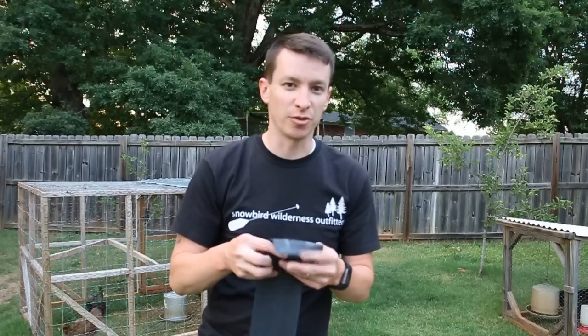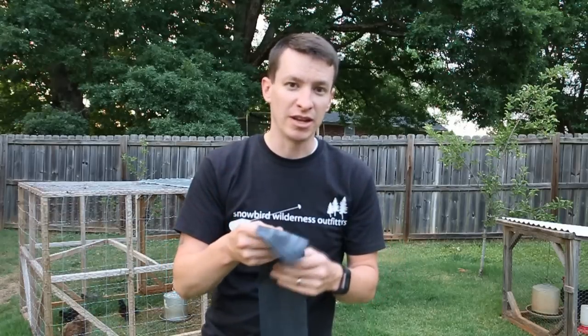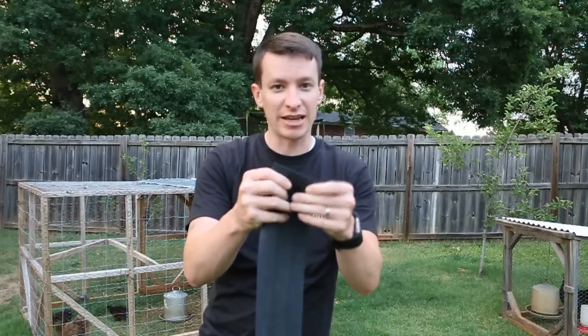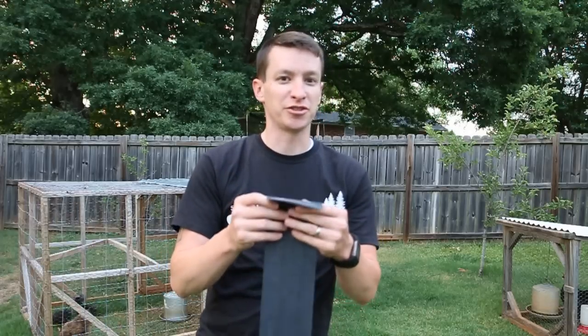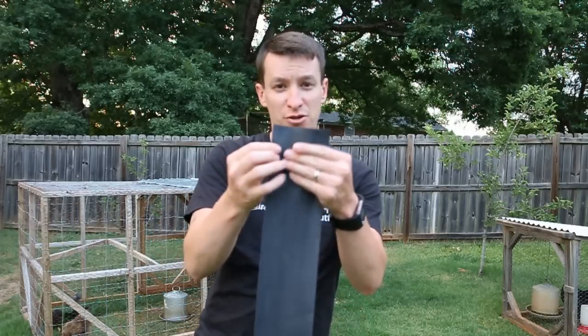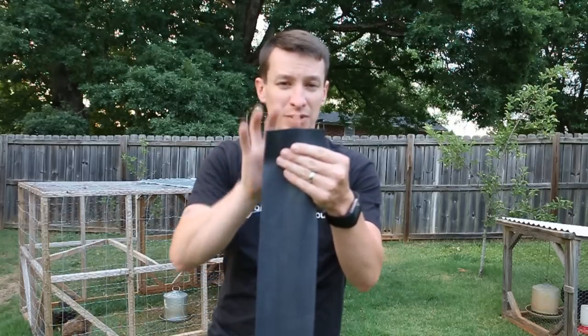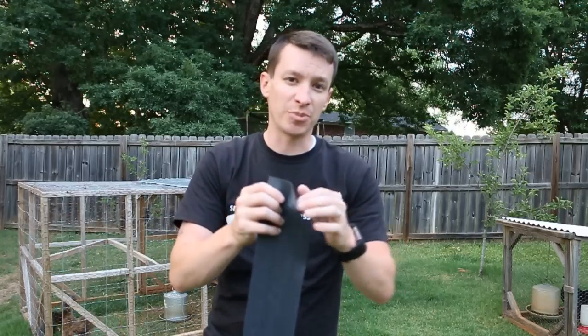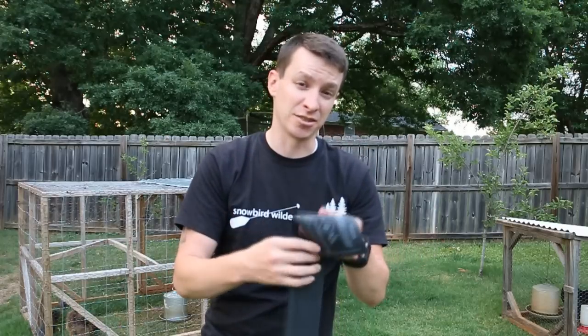There are two things the SWAT-T tourniquet has going for it: first, it's wide. Remember, the wider the tourniquet, the less pressure needed to cut off blood flow. Second, when pulled tight, it provides even pressure all the way across the tourniquet, which is a great plus. Some tourniquets only provide pressure on the edge, but none provide as much gradual even pressure across the whole width as the SWAT-T.